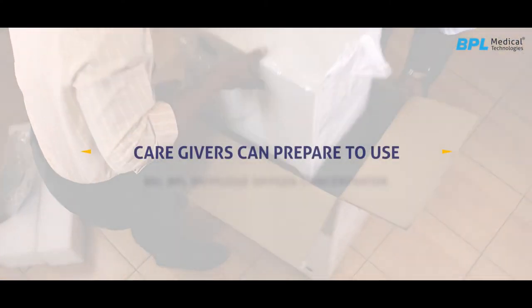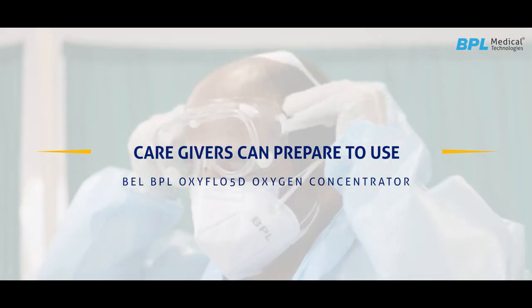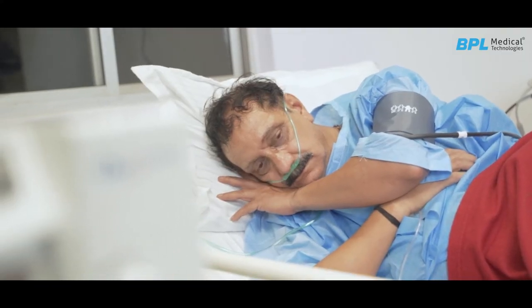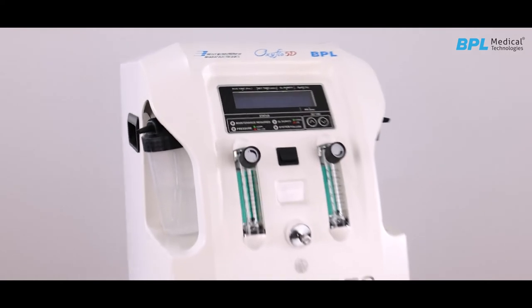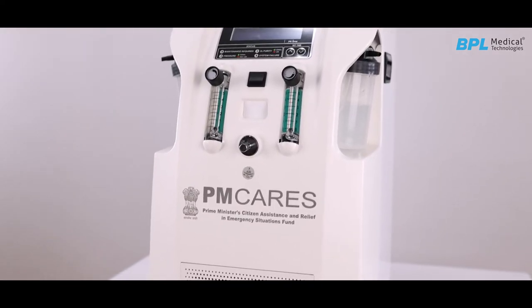After unboxing and knowing safety measures, caregivers can prepare to use the oxygen concentrator. Place the oxygen concentrator near to the patient. Oxiflow 5D has a dual outlet flow with a separate humidifier bottle separated through a bacterial filter.